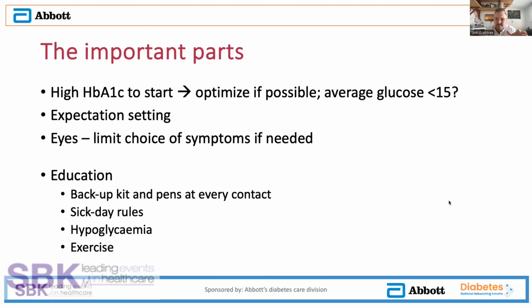And during that time period where the patient is getting used to the pump and the pump is getting used to the patient, it's important that they interfere with it as little as possible. So try not to do things like fake carbohydrates, try not to use settings like boost or ease off if they can help it, because all of those will interfere with the learning of the algorithm. And then the algorithm will almost set an expectation that they're going to maintain those behaviors in the long term to get the results that it's giving. So we really need to be careful about expectation setting.